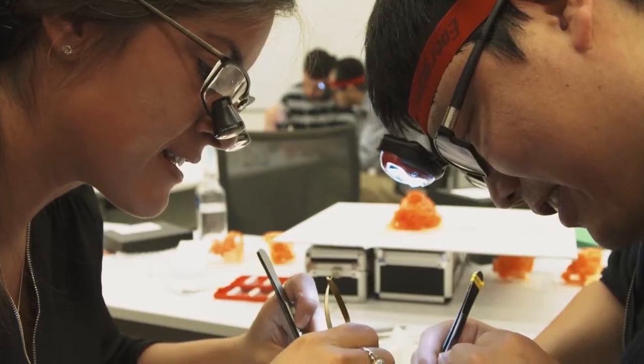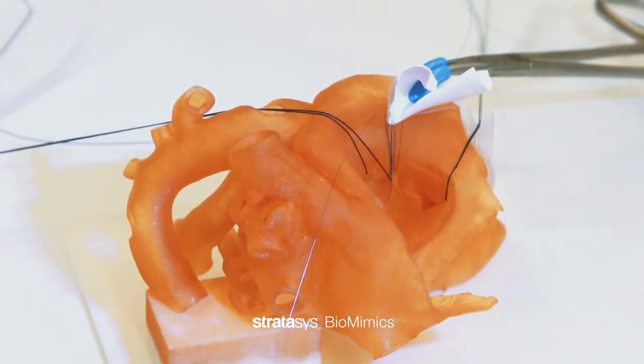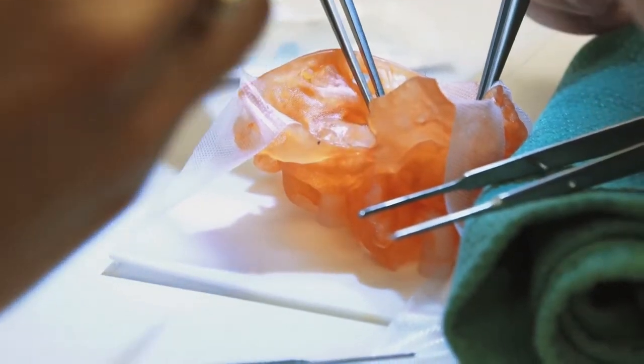Since 2015, we have organized eight courses using 3D print models for surgical simulation training. This is the first time in history that we are providing real physical models for practice.